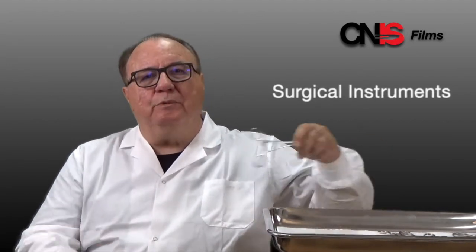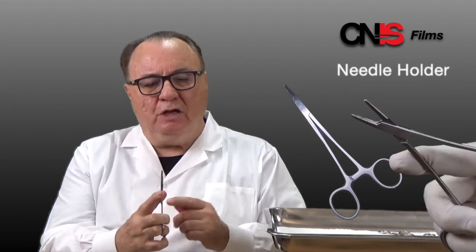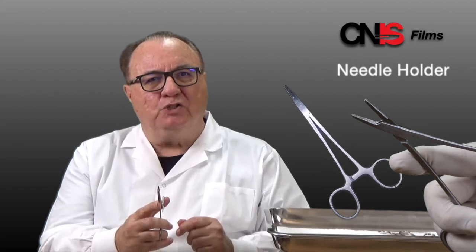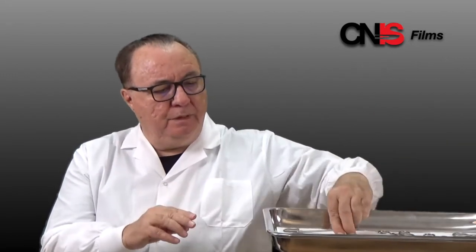You need to know the instruments to be able to do minor surgery. The first instrument is the needle holder. The needle holder grasps the needle in the jaws. The jaws are scored with an X so that the needle will not slip. When you are doing surgery you usually use two hands, so you'll have your needle holder in one hand and another forcep in your other hand.